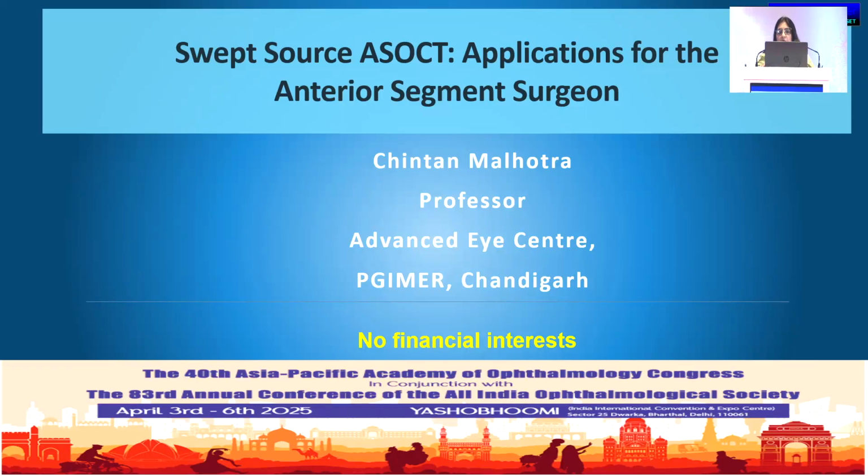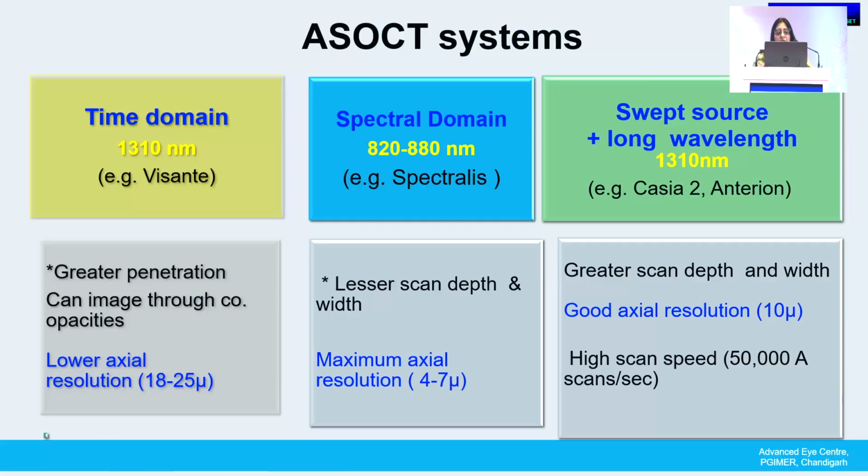What I'll be speaking about over the next 10-12 minutes is the swept source OCT and how it can help us as anterior segment surgeons. If we go to the ASOCT systems, there are different technologies available: the time domain, the spectral domain, and the swept source OCTs. Each of these has different properties.